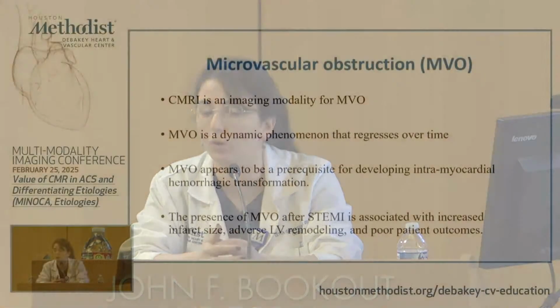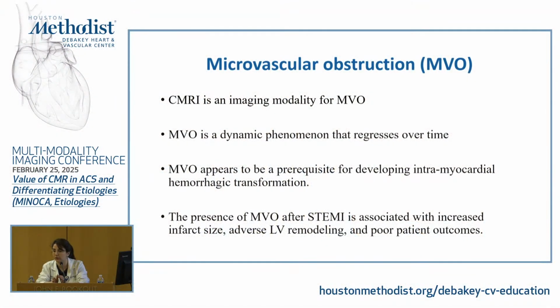About microvascular obstruction, there is a way to judge it. After the reperfusion, if we had slow reflow or no reflow, or if the EKG showed persistent ST elevation, those are all signs that, although we opened the vessel, on the microvascular and capillary level there is still obstruction. MRI is the diagnostic modality for that because it is very clearly seen.